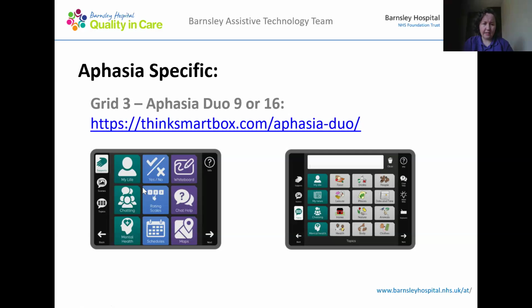And then you've got some social phrases that you might use when interacting with families or carers. So it's designed to consider what's important, usually, to people with aphasia. Well, it was designed in collaboration with people with aphasia. It's got different types of topics as well, like what you'd see in Let Me Talk, so food, drink, people. And then it's got visual scenes.